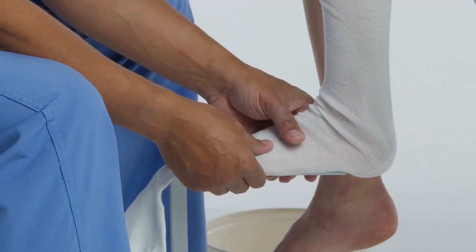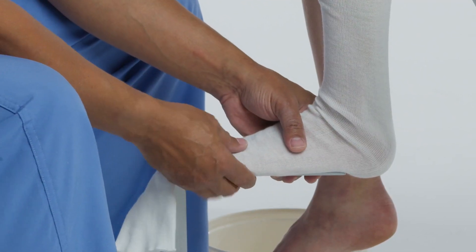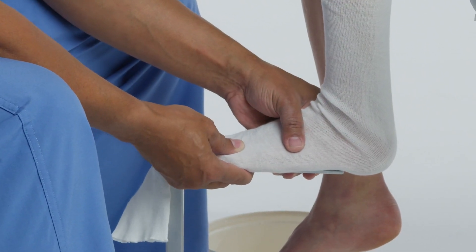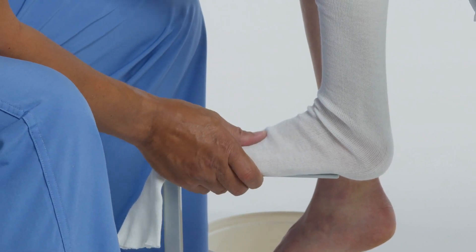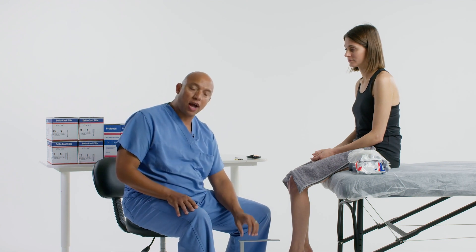We're going to make sure that the patient is in a neutral position and we're going to be using a footstand. This is a device that helps place the foot in the proper position, but it's one that's underutilized because you have to take it off at a certain time. If the patient is weak or there is a lot of pain, you have to learn how to use this unless you have an assistant.